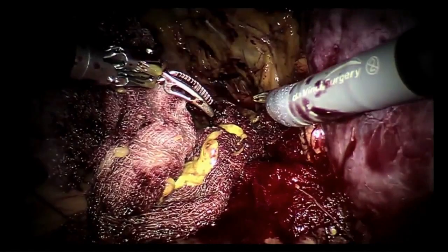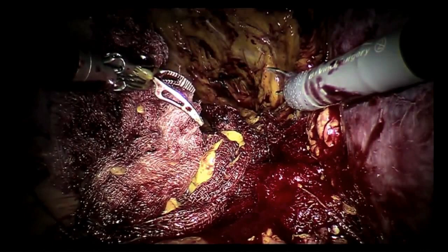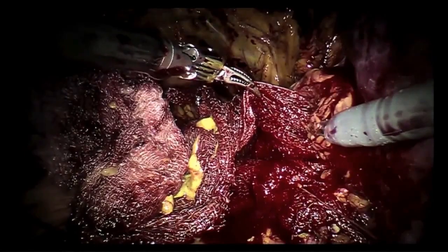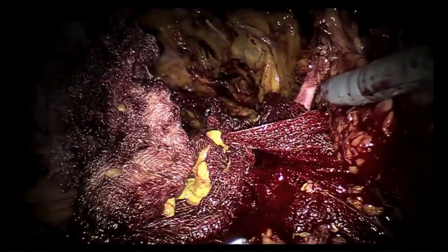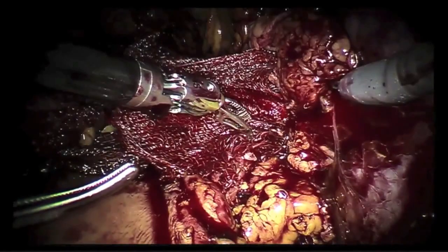So I just must compliment your name again. Dr. Polat, the amazing transplant surgeon here. He is really amazing, and he did just the most beautiful dissection on the back table. As you can see, there is no bleeding happening from the renal hilum at all. So that just attests to his excellence, and I'm very impressed. He's done 300 liver transplants here, and I'm already talking to him to come to USC, spend some time together, and let's see if we can do some robotic liver transplants. Just trying to find cases for you, Vito, for the next challenges.